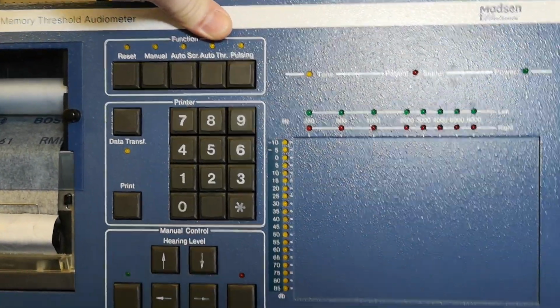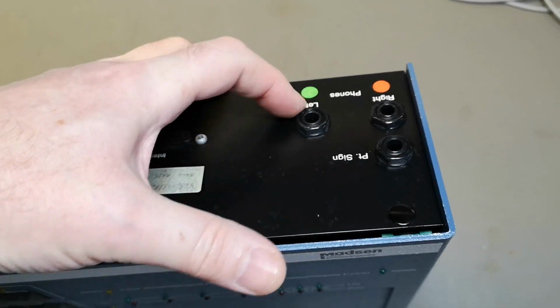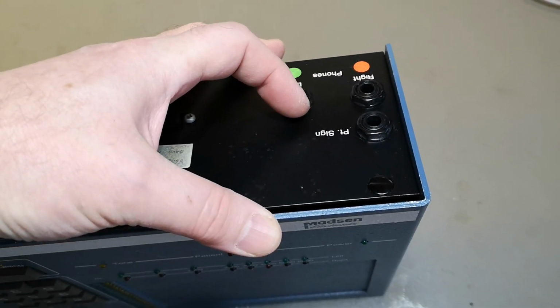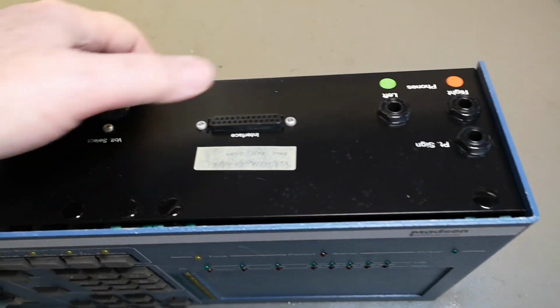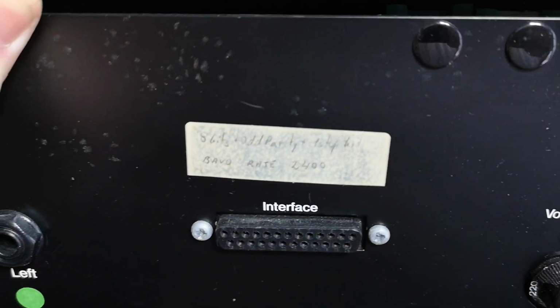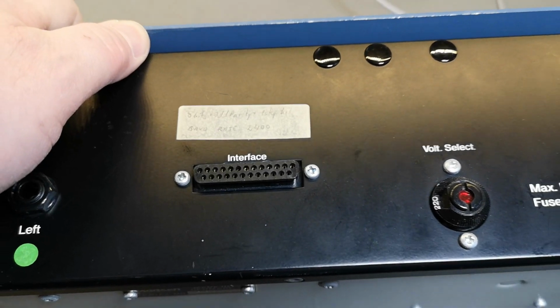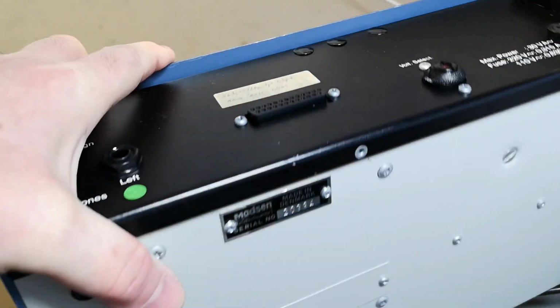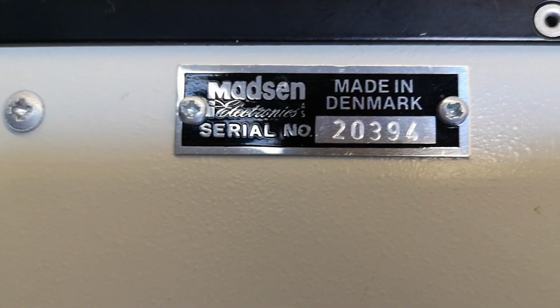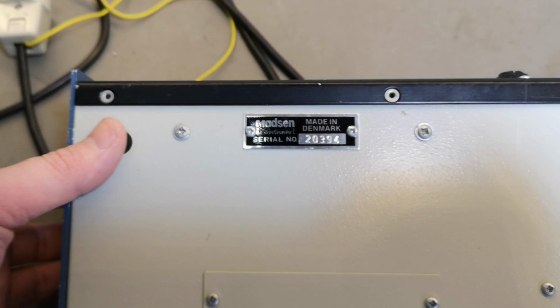And let's have a look here. See, headphones. And the fun thing is that we got separate jacks for left and right, and then that is the patient signal. And then there's a serial port. Let me show you. So there's some text here. It says something about 8 bits odd parity, to, I don't know, baud rate 2400, right? So it's definitely a serial interface. And what else can we get out of this? See? Madsen Electronics AS and a serial number and made in Denmark. That's all I know. How old is this and whatnot, I don't know yet.